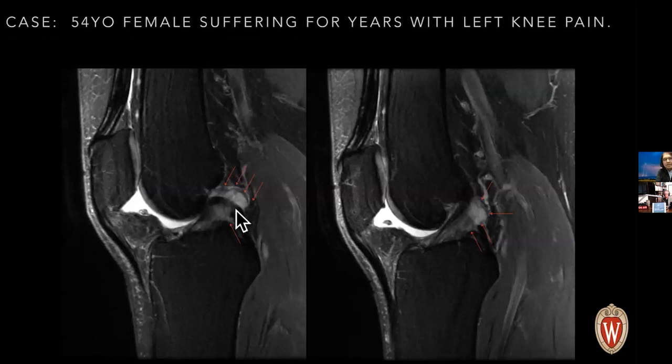This is in retrospect what we were looking at. So to us radiologists, this is just tissue that we just don't know what lives there normally. So this should have maybe been picked up, and now hopefully we'll pay attention to this kind of finding. But it's not unusual to see such heterogeneity in this part of the knee. So that's why all of us would have said this is a normal knee. This doesn't look like anything to us, and it's not particularly brighter than water. So that's why it doesn't really register with us, but that's probably what it was.